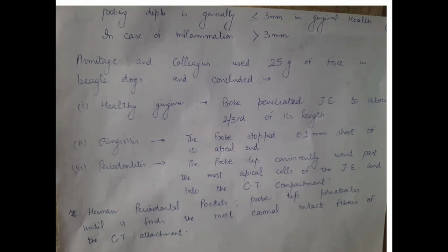Armitage and colleagues in their landmark study conducted experiments in beagle dogs with 25 grams of force, and they concluded that in case of healthy gingiva, the probe penetrated junctional epithelium to about two-thirds of its length. Means when the gingiva is healthy, when there are no clinical signs of inflammation, the probe went up to the depth of two-thirds of the length of the junctional epithelium.